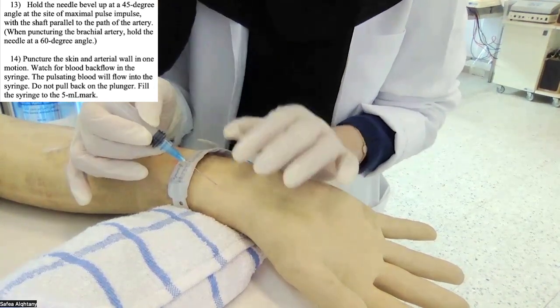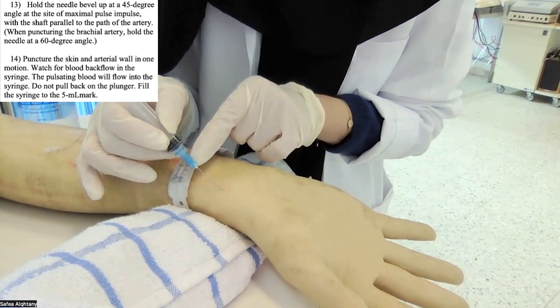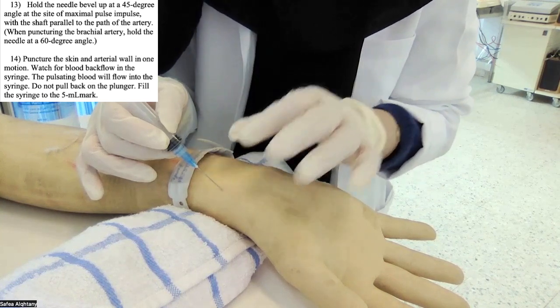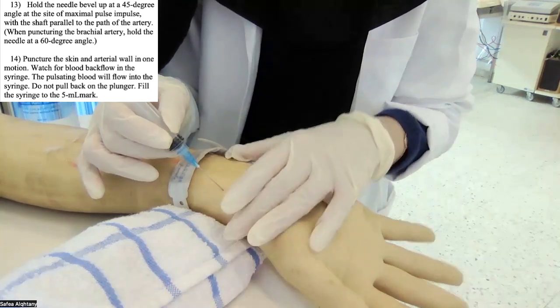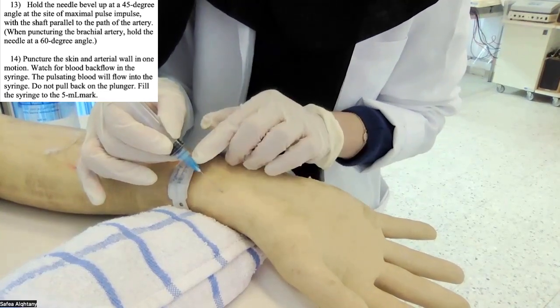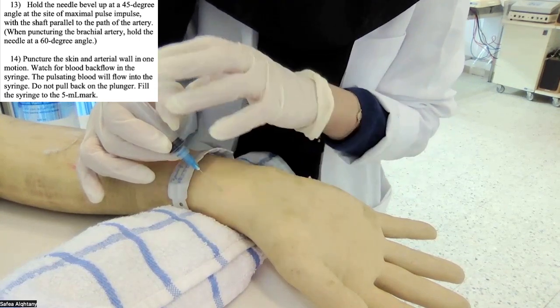طبعا insert in one motion. At the same time, I need to watch the blood backflow in the hub of the syringe. Okay, I stop advance the syringe، يعني ما أجلس أكمل أضغطها للأخير، لا، أوقف مجرد ما أشوف البلد backflow and allow the syringe to fill itself.